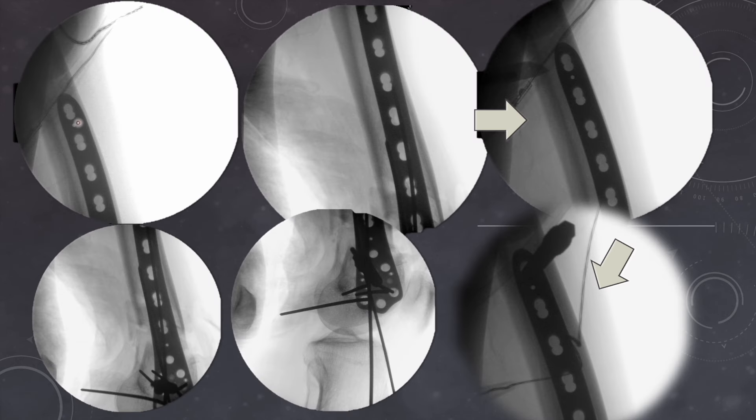We have positioned the plate in lateral view, and you see the proximal part of the plate is slightly anterior. But the plate is in a good position at the articular part. After restoring the length of the fracture, we can put a stab incision while checking the lateral view at a position which is slightly posterior or central over the diaphysis. Through that stab incision, we can pass an artery forceps and feel for the locking hole, then pass our sleeve through that stab incision and lock it in the locking hole. With that sleeve, we can actually toggle it posteriorly to make it centralized over the diaphysis. The plate has been slid to a central location with the help of the sleeve.